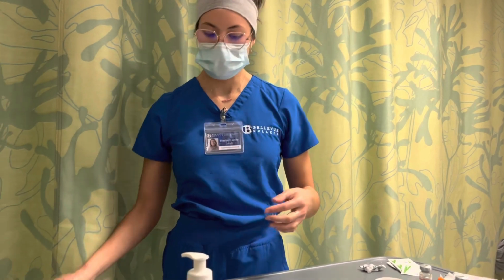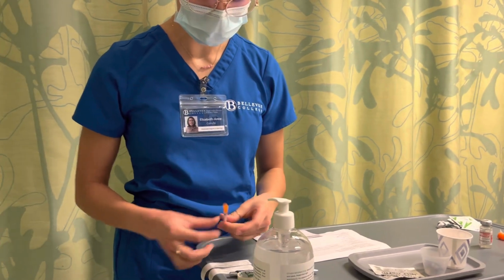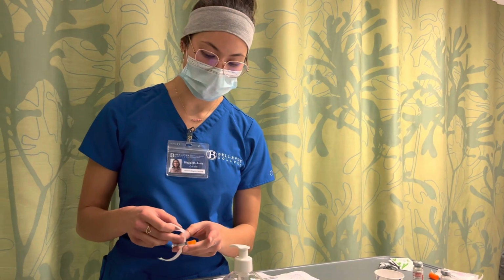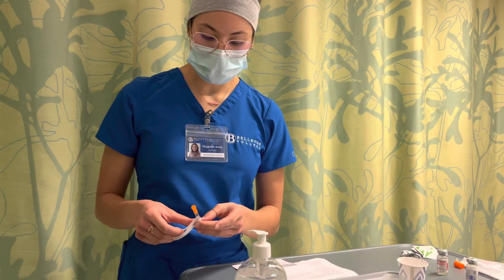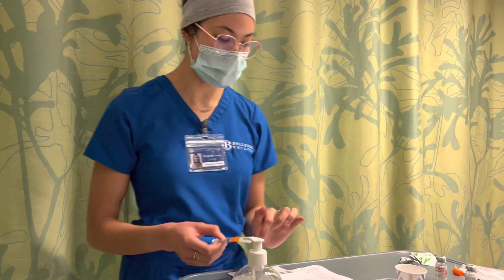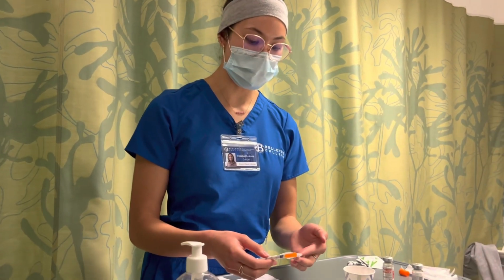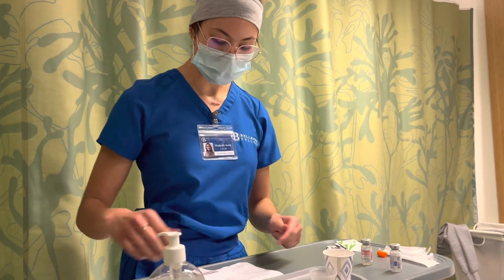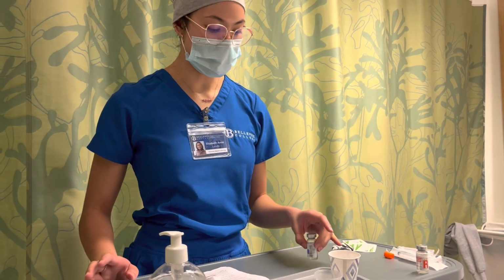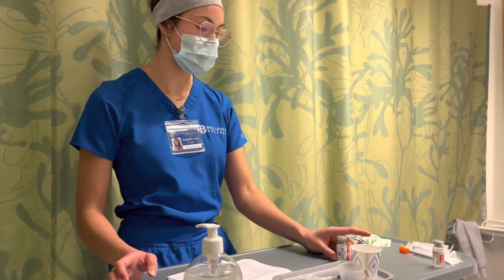That is 10 units. And I'm going to label this, making sure that we can still see the amount of medication that we're giving. So I have this labeled with the medication, the dosage, the patient's name and date of birth, and my initials with the date and time on there. And then that's our insulin. Then we also have Ketorolac ordered, which is a pain medication.